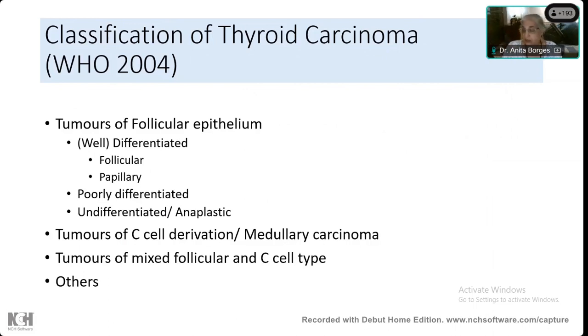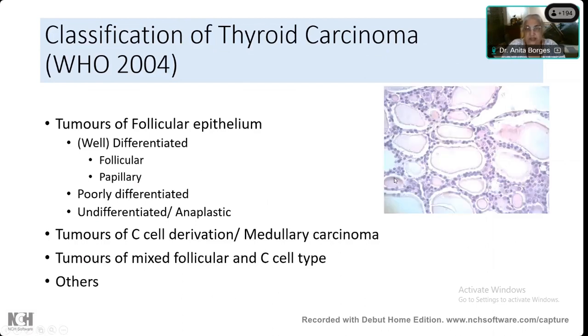Well, it's very important to bother about it for the simple reason that those who forget history are doomed to repeat it. All right, so now let us see. This is, for all practical purposes, normal thyroid. Okay, and what is the normal thyroid made up of?